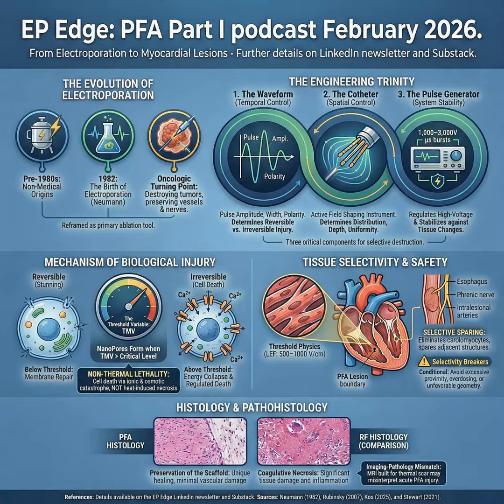Pulse amplitude is the dominant lever. Increase amplitude and you increase induced transmembrane voltage. You increase the probability of exceeding lethal thresholds, and you expand the spatial extent of irreversible injury. But amplitude is also where off-target effects rise. Field spill into adjacent tissues, blood pool exposure, and platform-specific risks like hemolysis or unintended neuromuscular capture.